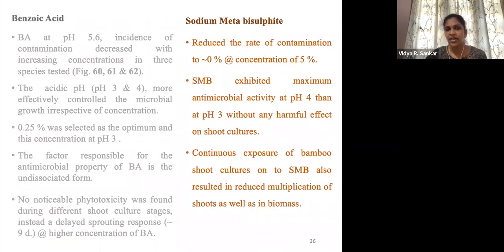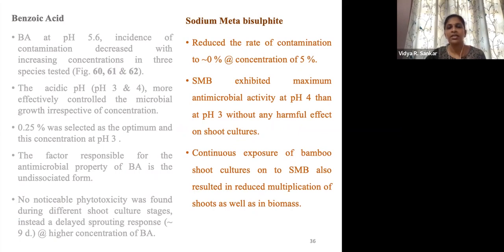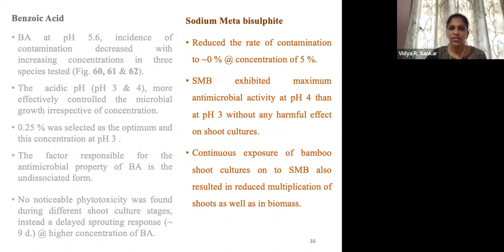We also used benzoic acid, sodium benzoate, and sodium metabisulfite. Sodium metabisulfite is not recommended because continuous exposure results in reduced multiplication of shoots as well as reduced biomass. In the case of sodium benzoate or benzoic acid, it is found to be very effective for controlling contamination in all stages and also has some growth-promoting properties.